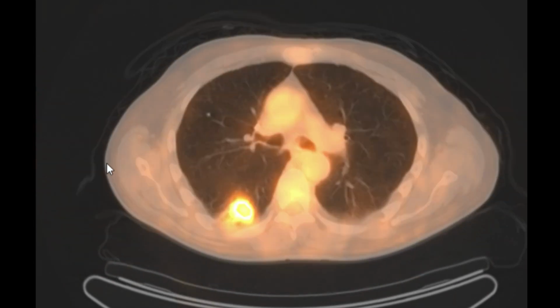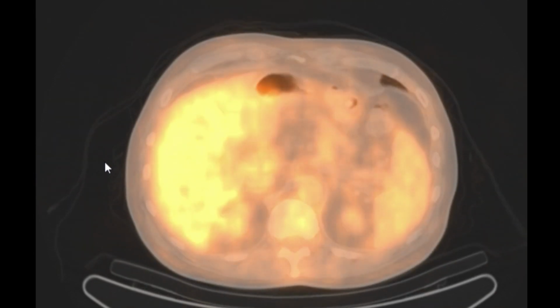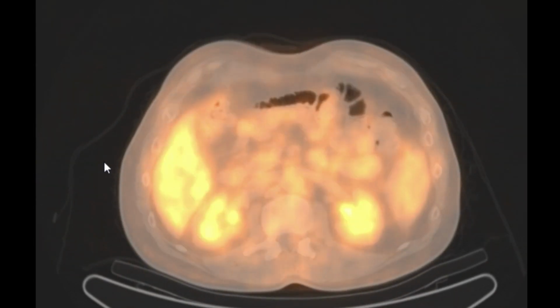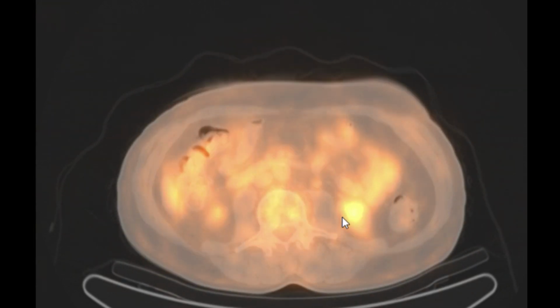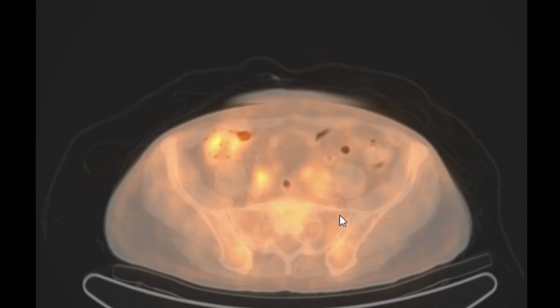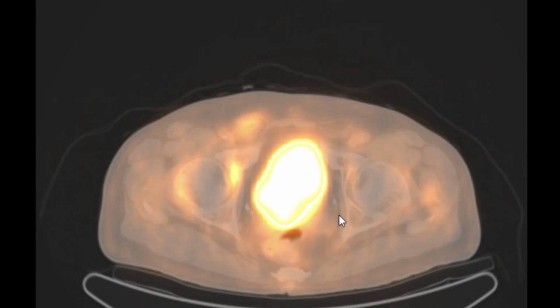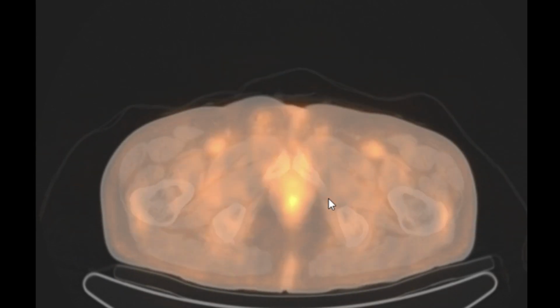All right, now there's a lot of non-specific uptake, like you'll see activity in the heart there, the liver. As it's being cleared out, you'll see activity in the kidneys. If I can scroll down and find the bladder, you'll see lots of activity down there as well. There we go. So good for staging and very sensitive.